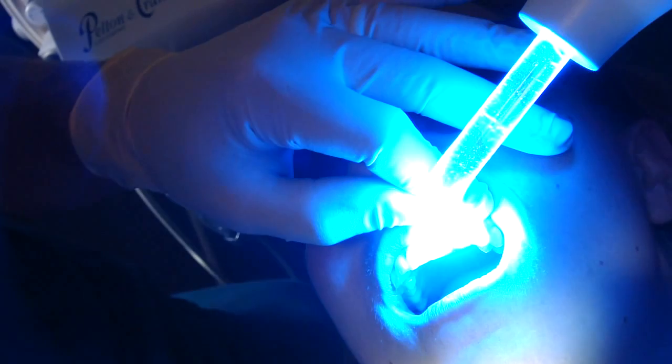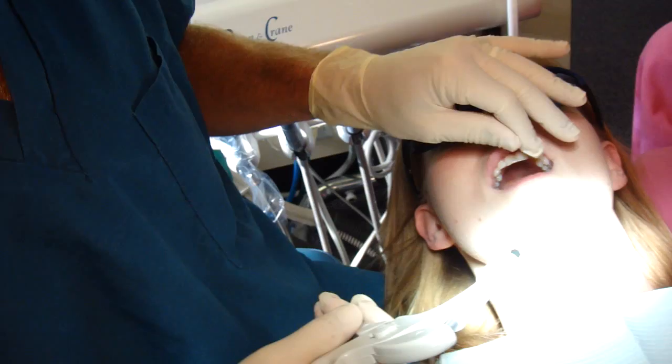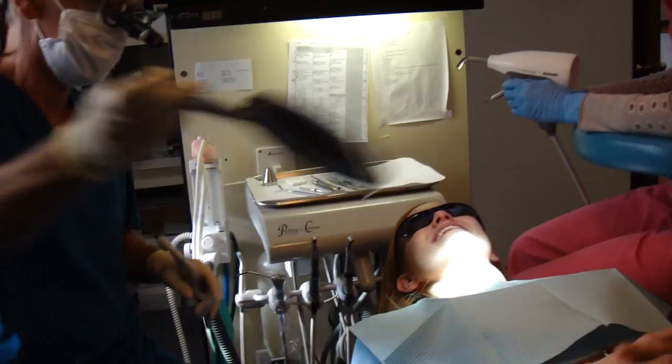Okay, go ahead and hit that with a light. So I'm going to give you a mirror. This isn't done yet, okay? But it's better. Okay.